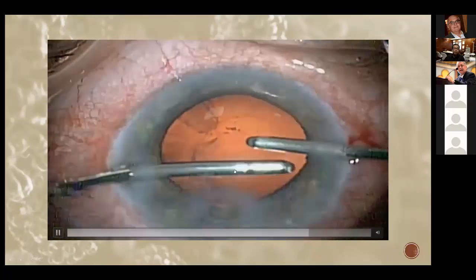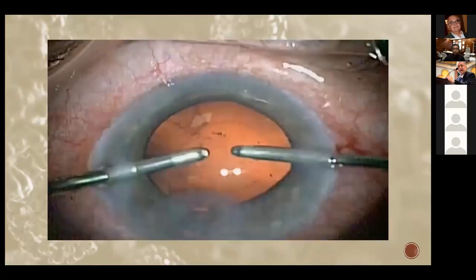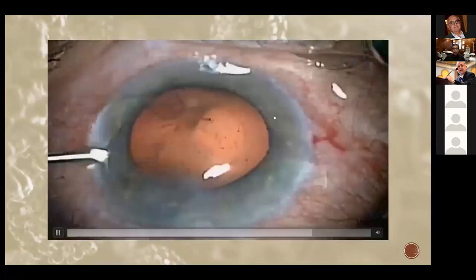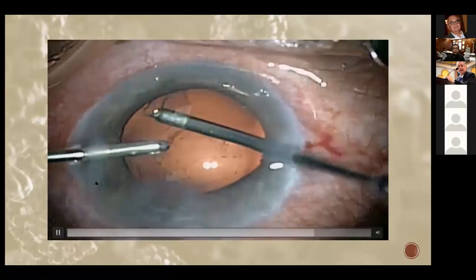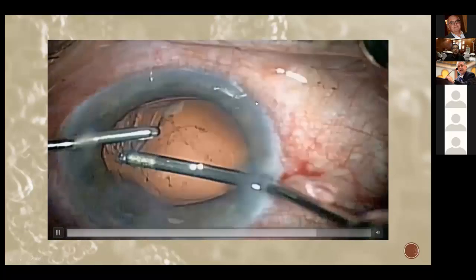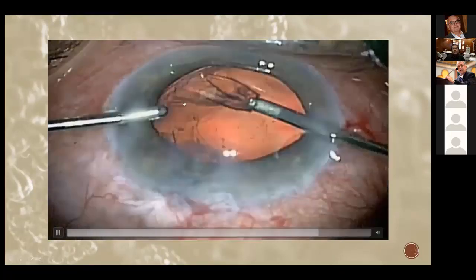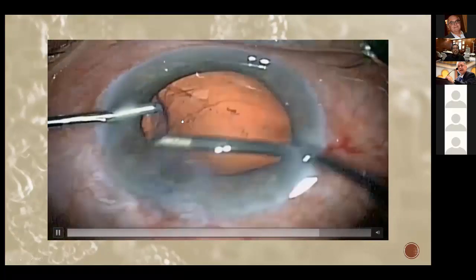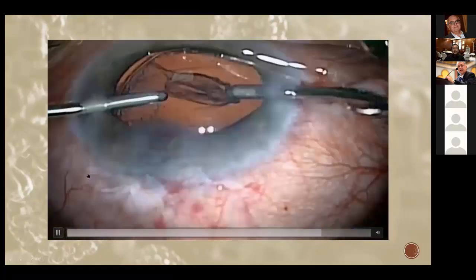So you don't exert a central pulling. If you pull central, it means you're exerting very high pressure on the zonules here and here. So you go and do tangential to release it. As you can see, these lens material are behind the capsular tension ring. And this is why people don't prefer to put the capsular tension ring at the beginning.